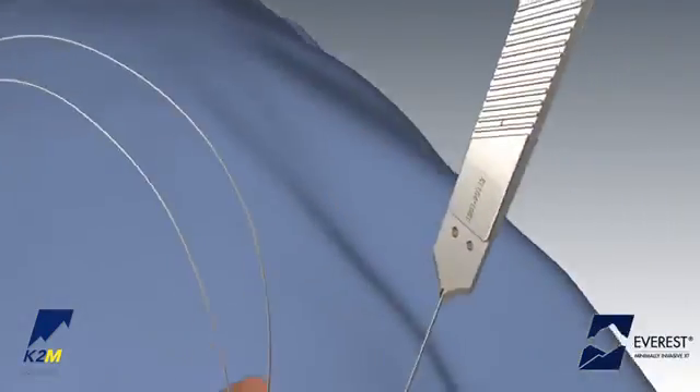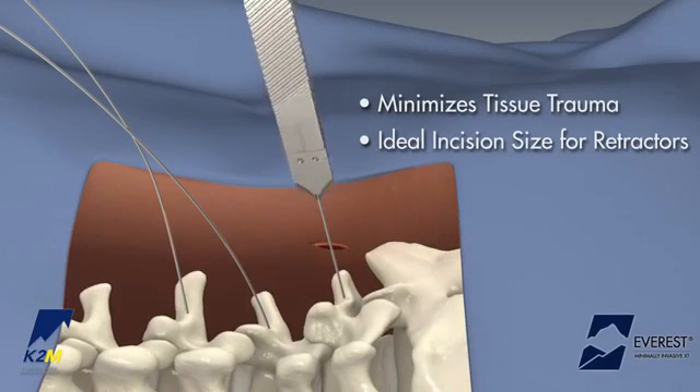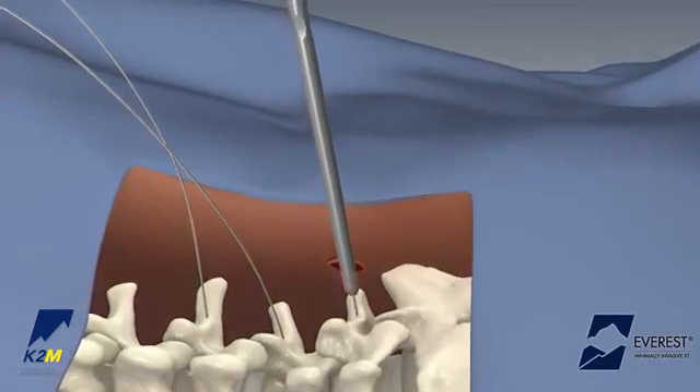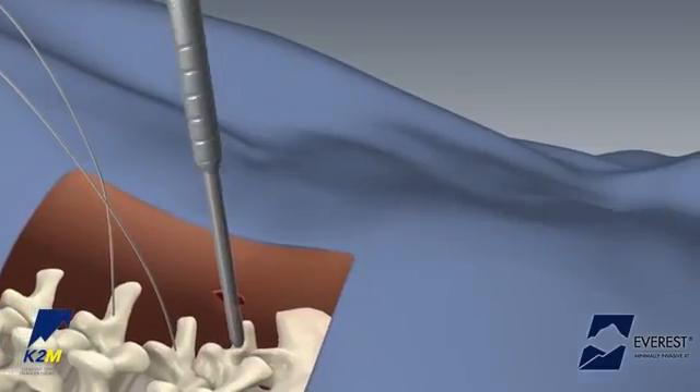Position the cannulated perfect scalpel over the guide wire and advance through the fascia to create a consistent fascial incision. In preparation for tapping the pedicle, place the inner dilator over the guide wire and advance through the muscle to the pedicle, ensuring a flush position with the bony anatomy.